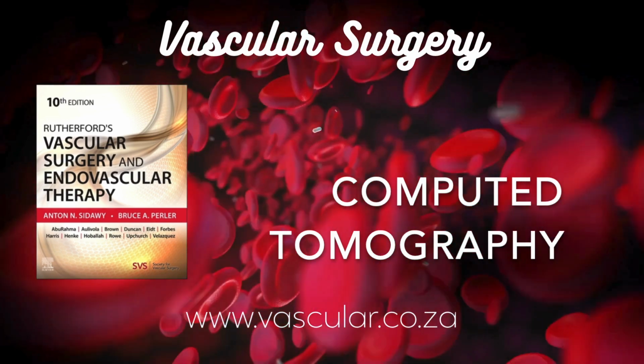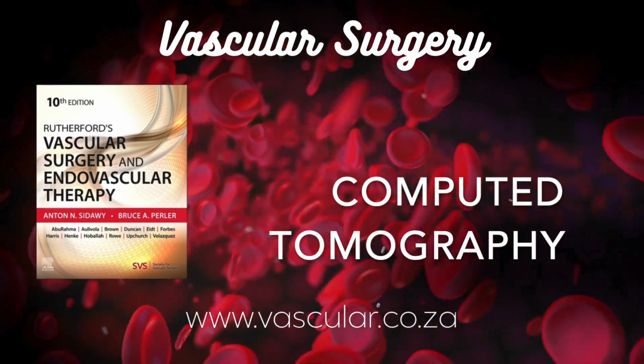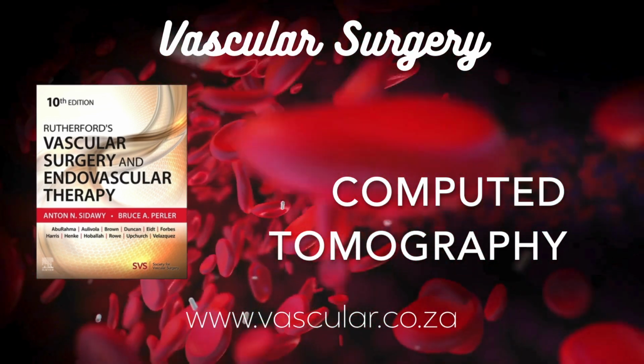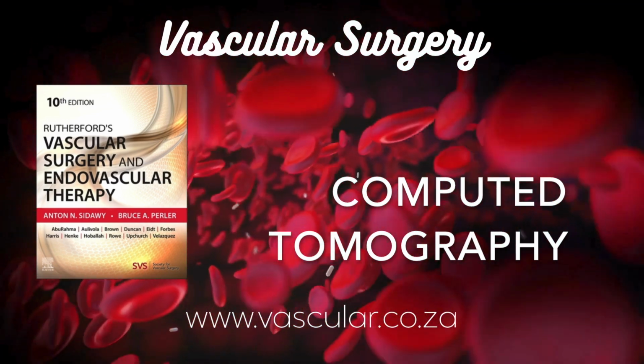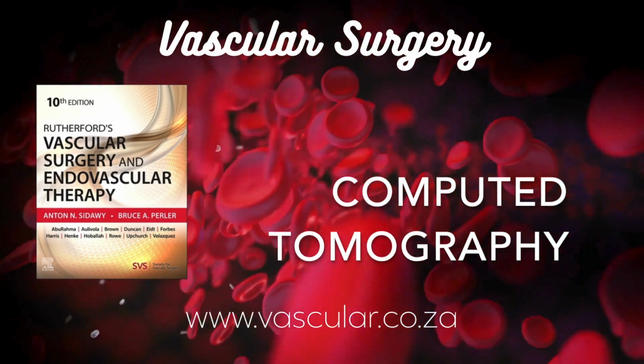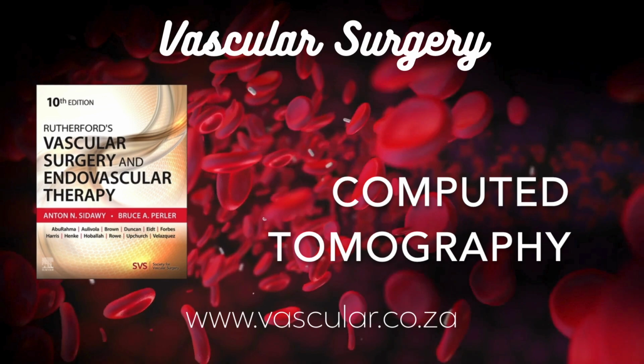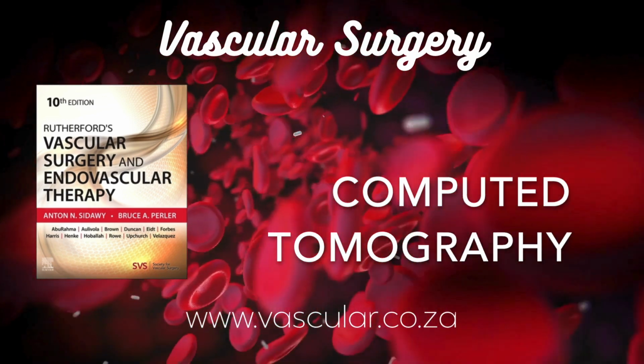Wait, so we've got these incredibly detailed 3D data sets. But how do we actually see the blood vessels specifically? They're just soft tissue, density-wise. That's where CTA comes in, computed tomography angiography. I get it. On a non-contrast CT, blood vessels look pretty much the same density as the surrounding muscles and organs. Hard to pick them out.